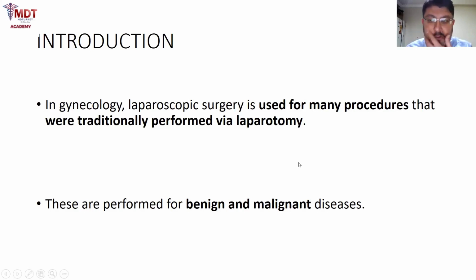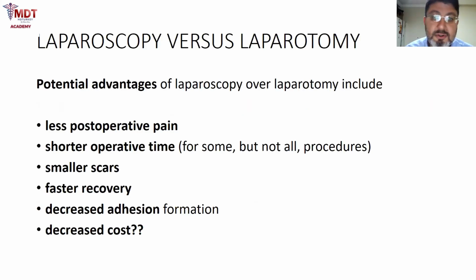As you know, we use laparoscopy for many procedures, for either benign or malignant disease, and we can perform every surgery that we perform by laparotomy. It has a big advantage in the field of gynecologic surgery.